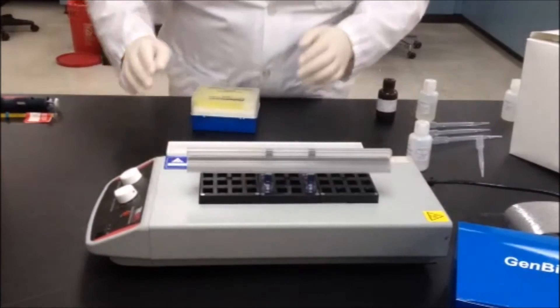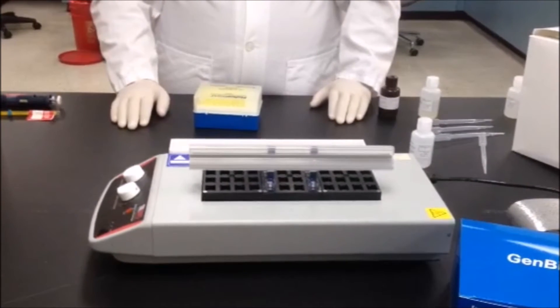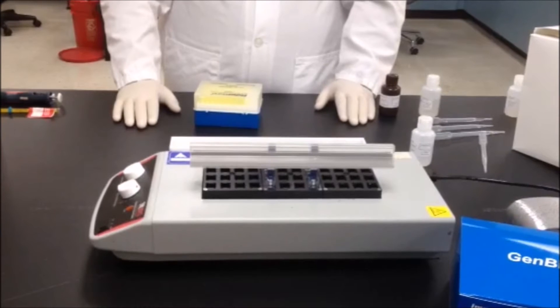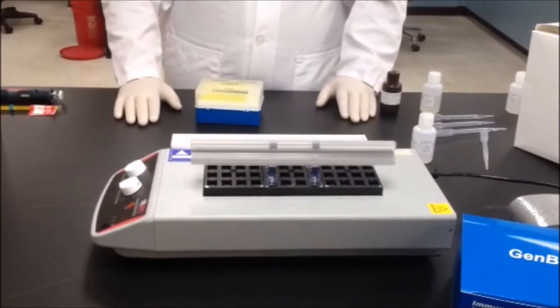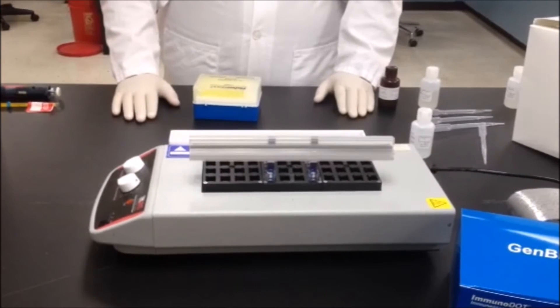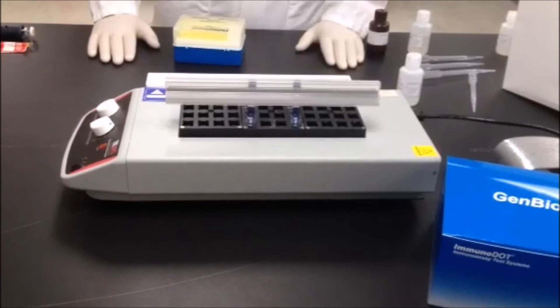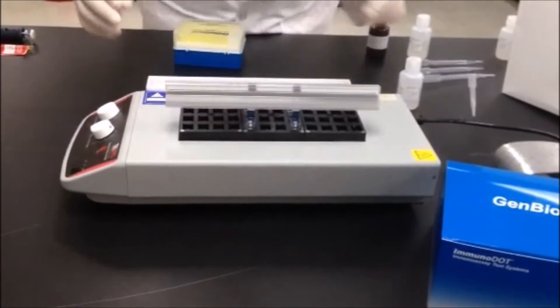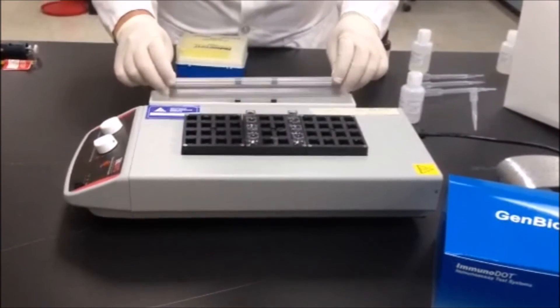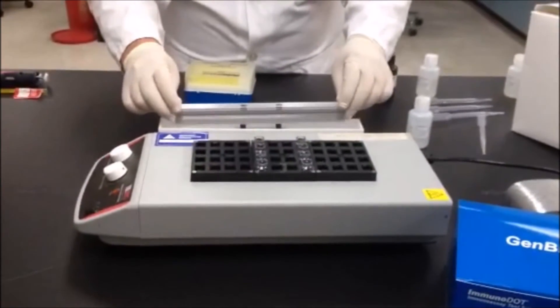Allow the reaction strip to incubate with the diluted patient serum in the first reaction vessel for the time specified in the package insert. This time varies by kit type and is dependent upon the antibody type for which you're analyzing. After incubation, remove the assay strip from the first reaction vessel and wash it by swishing 5 to 10 seconds in the wash trough.